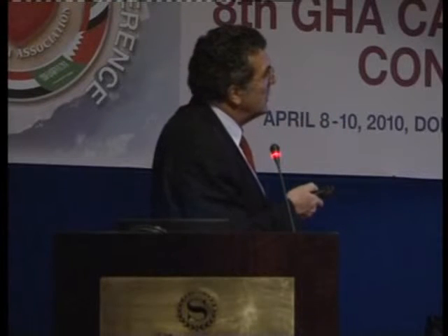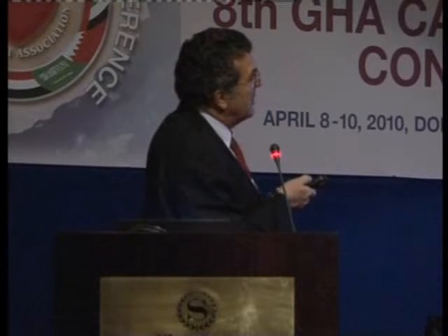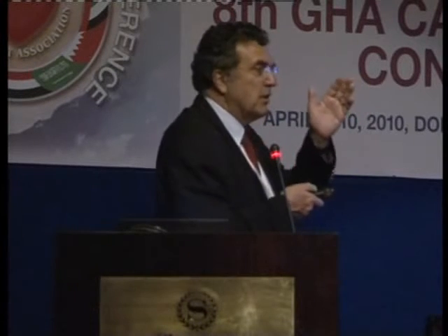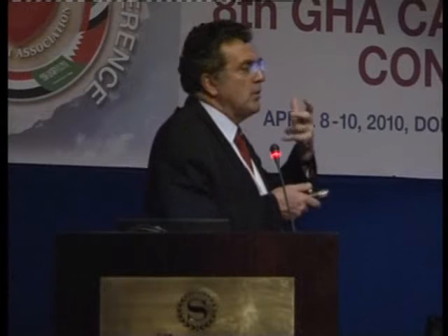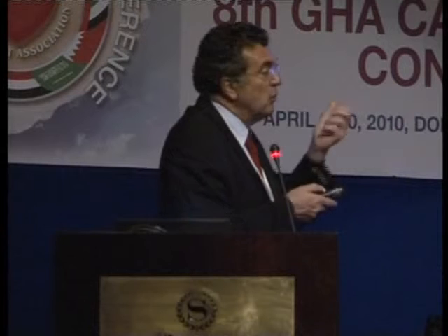Particularly here, this lesion is more critical now on the proximal part of the diagonal than on the baseline angiography. So I think the final evaluation will be to inject nitroglycerin, remove the wire, and then redo the angiography.